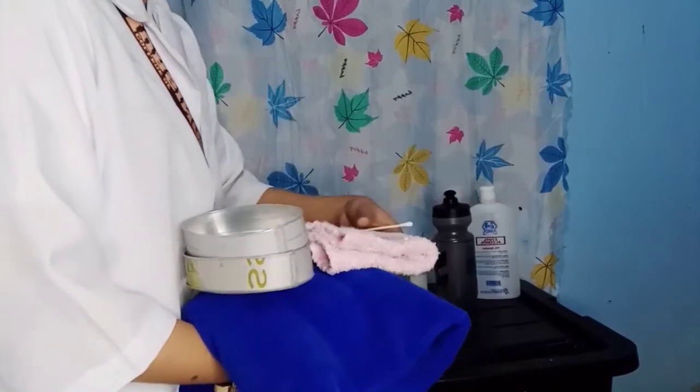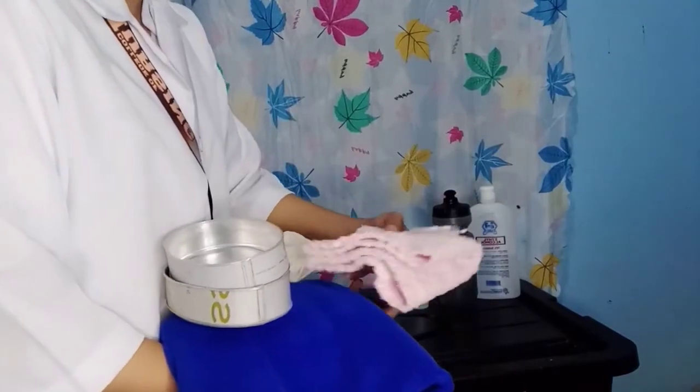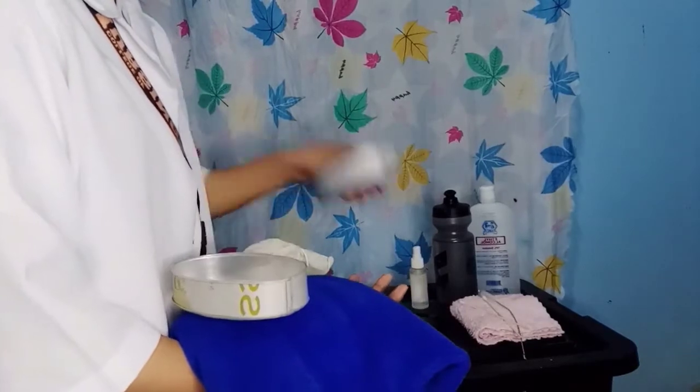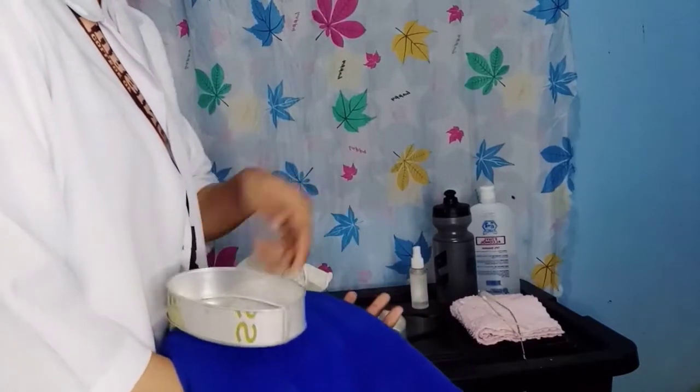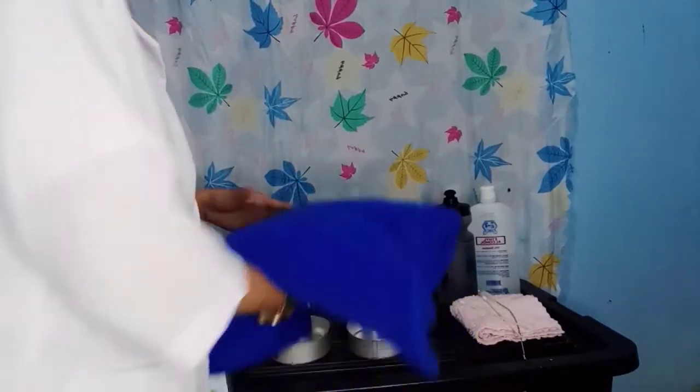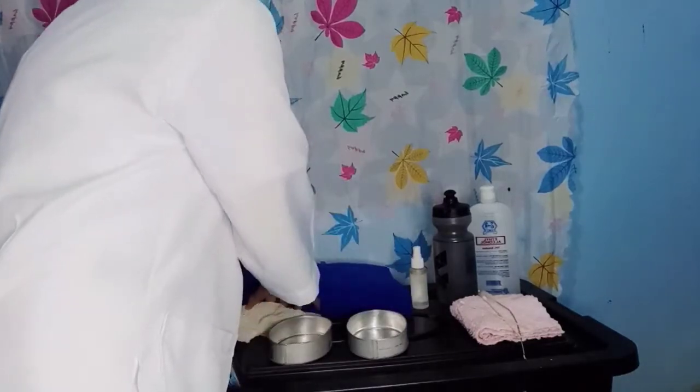For the implementation: first, we need to bring the necessary equipment to the bedside stand or over-bed table. Next, perform hand hygiene and put on PPE if indicated.